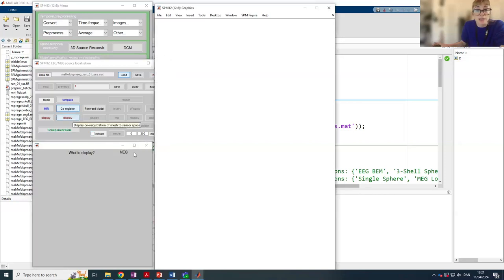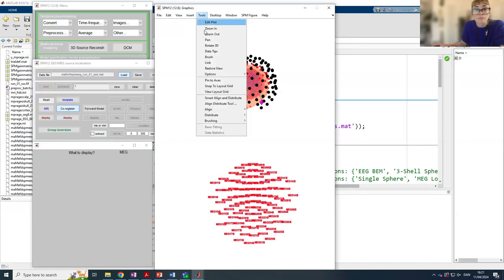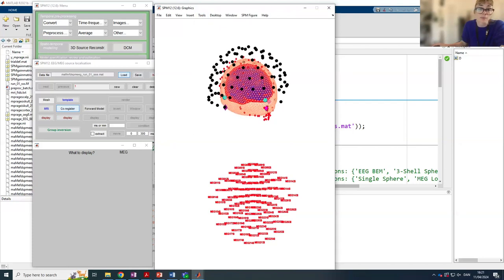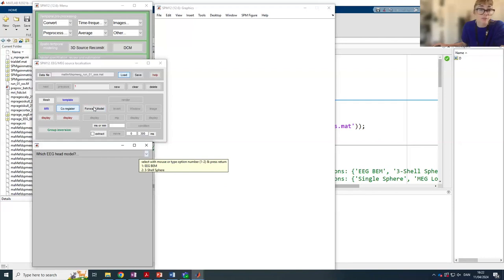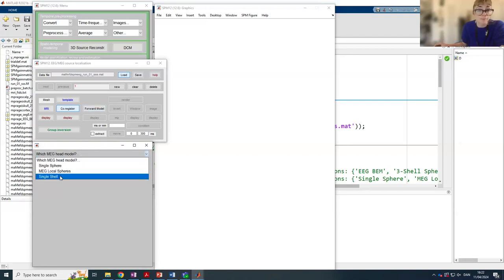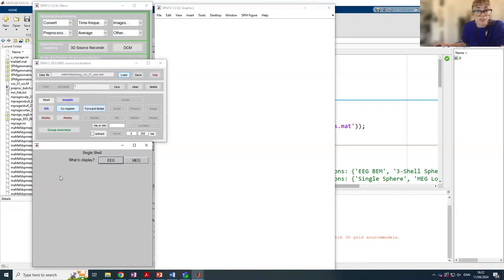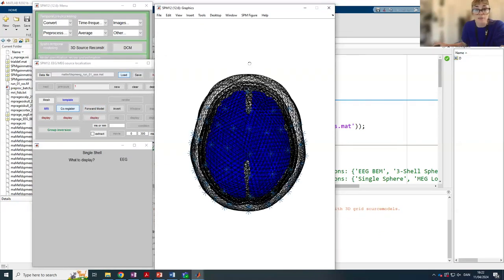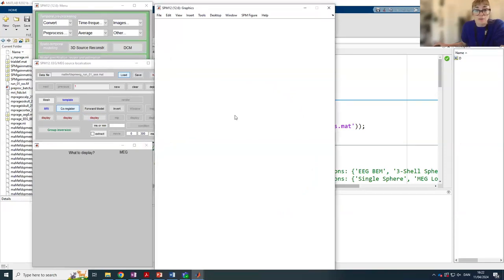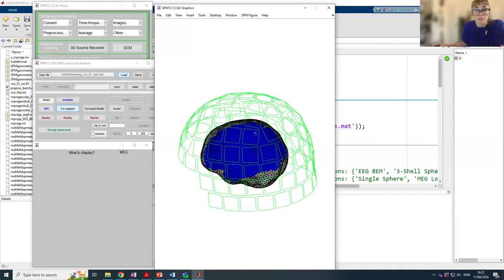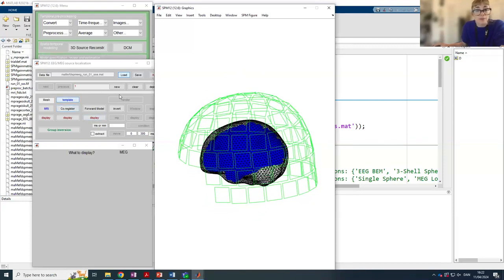We can also look at the MEG co-registration results, checking that sensors are positioned appropriately with respect to the scalp — this also looks quite good. Now we've co-registered our two coordinate systems and we're ready to compute our forward model. We need to choose a volume conductor for each modality: for EEG we recommend the boundary element model, and for MEG we recommend the single shell model. We can inspect our forward models — the EEG boundary element model has multiple shells as expected, and the MEG forward model has a single shell, also as expected.